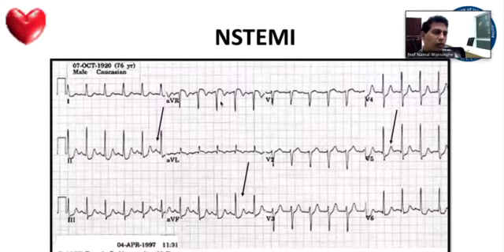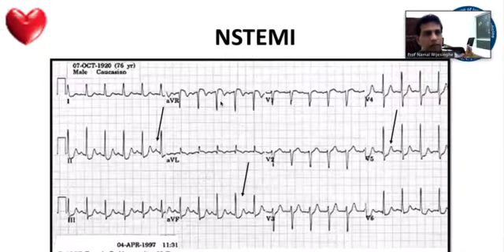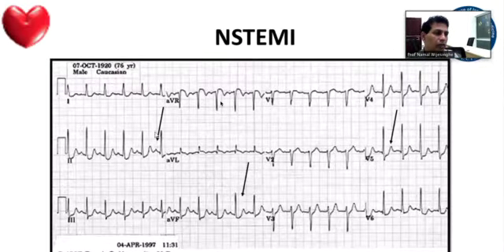Now, the next very important ECGs are the ECGs of ischemia. I showed you ventricular tachycardia, I showed you others, so those are all important ECGs. But here, non-STEMI or unstable angina is identified by these ST segment depressions, as indicated by some of these arrows.